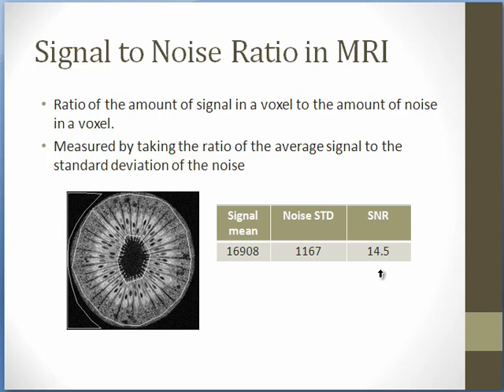I don't know if there's a particular number, but I think most radiologists, I've heard numbers around 30 is the lowest. And there are ways to ensure that your MRI machine is returning appropriate levels of SNR by doing calibrations or quality scans each morning before the patients are scanned.